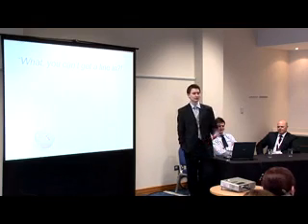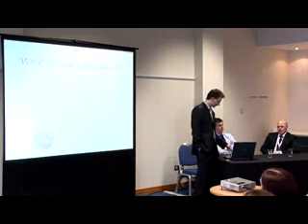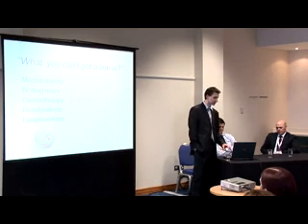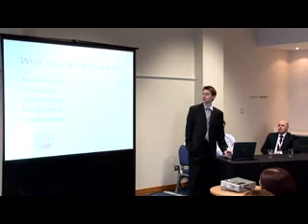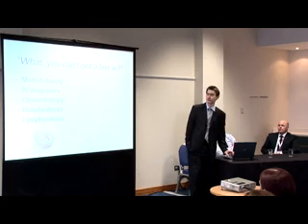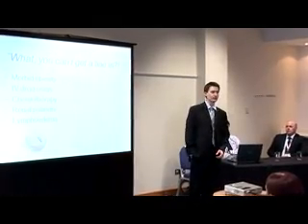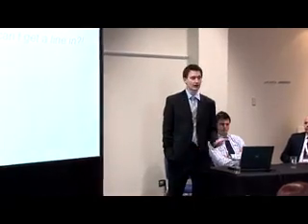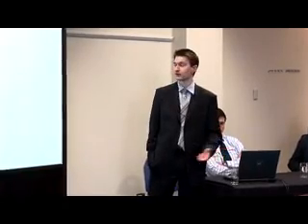So why are you going to do it? Well, if you can't get IV access, or if you need it in a hurry. You can't always get IV access when you need it quickly. I'm sure you can all think of quite a few situations in which it's been very difficult or impossible to get a line in. So, morbidly obese people who have got folds of skin on folds of skin, and you can't see or feel a peripheral vein anywhere. IV drug users who've used up all the peripheral veins, and often their femorals, sometimes their neck veins as well.